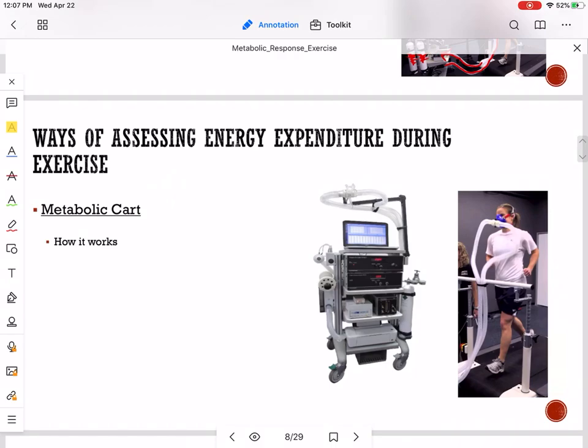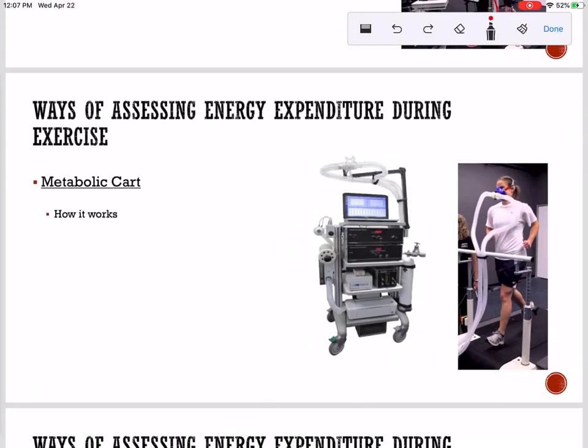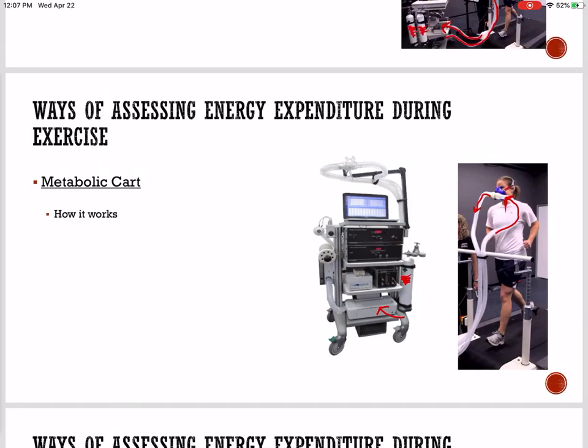Pretty cool. I really wish you could see it. All right, now here's the metabolic cart, and I've already talked to you a little bit about it. We can see that there's a gas chamber. There's actually two of them. As I talked about, this is a two-way non-rebreather, so it separates, so we can quantify the amount of air coming in, and we can quantify the amount of air coming out. The air coming out goes into a little mixing chamber that's able to analyze that air, and then come up with some estimates of how many calories we burned.